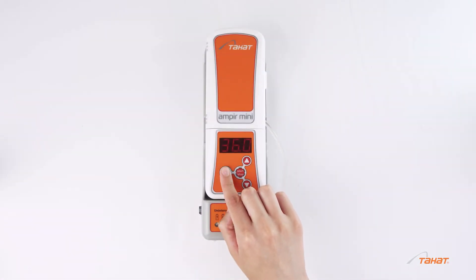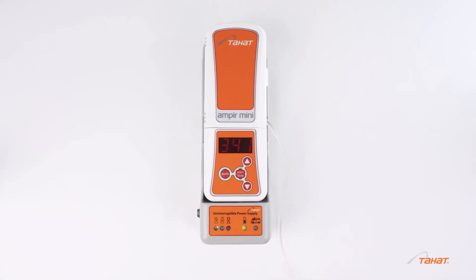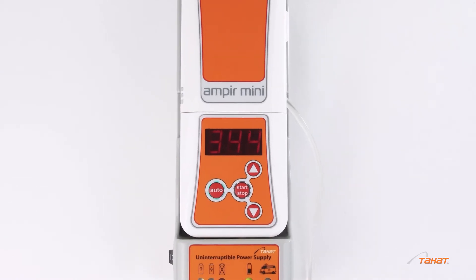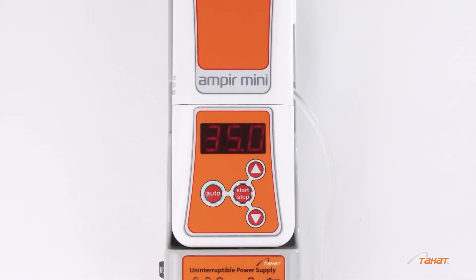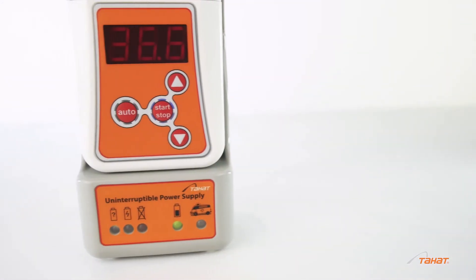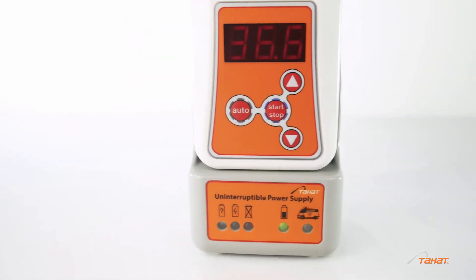Auto mode is intended only for the temperature of 36.6 degrees Celsius. Do not use auto mode for transfusions, as the heat exchanger temperature can reach 44 degrees Celsius while warming. When the set temperature is reached, the device will automatically maintain it.